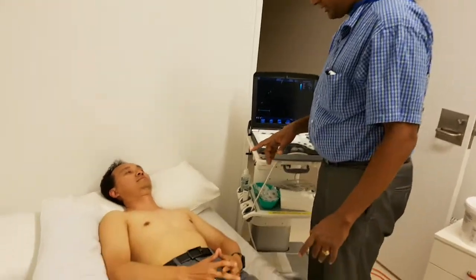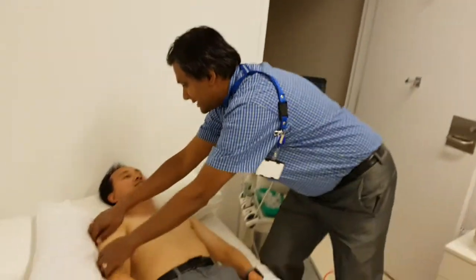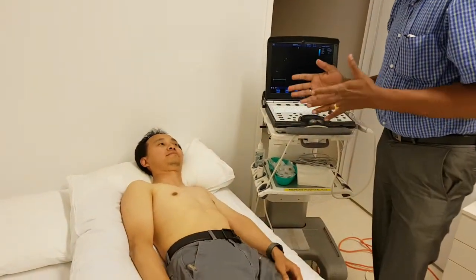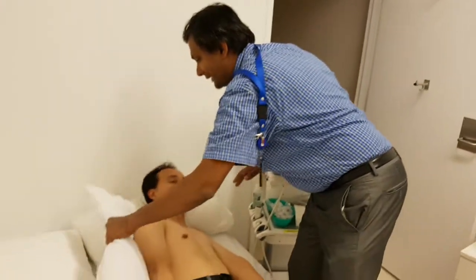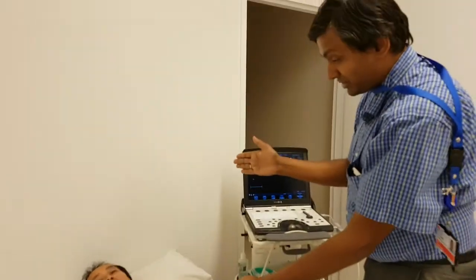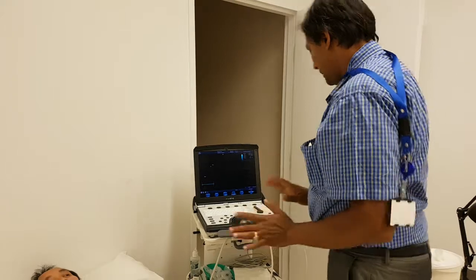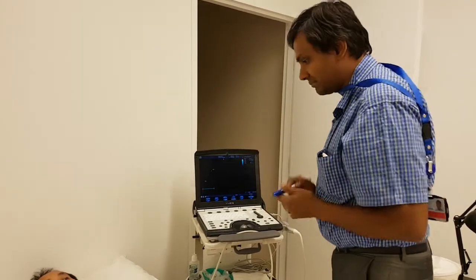The first thing is how you position the patient. The cardiologist would position the patient so that the heart gravitates towards the left. This is ideal, but in critically ill patients it may sometimes not be possible. So I would just do it in any position the patient is in, even if they are in the right lateral position. I very rarely change the patient's position right at the beginning, but if I don't get good enough images, then I do try to change the position.